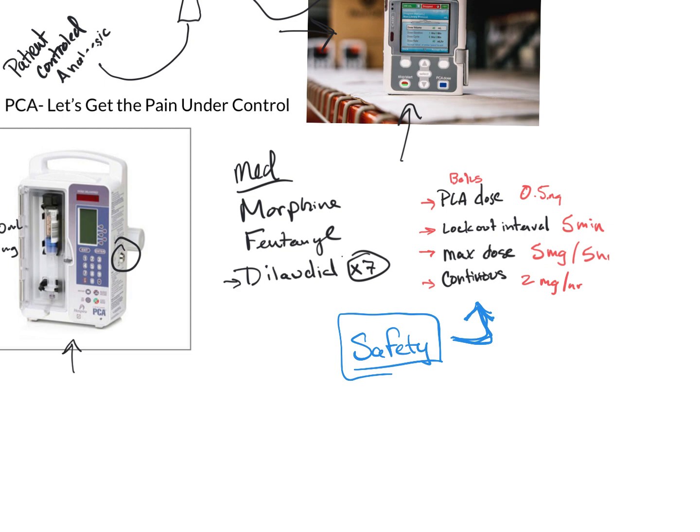So we want to make sure, protect yourself, protect your patient. I know you can set a pump. We can all push buttons. Here's the thing. We get busy, we overlook things, cursors move down to the next grid, whatever. So make sure you always have that second nurse check. All right. If you need to help them out by taking a task off their to-do list so they can come check it, great. Work as a team.